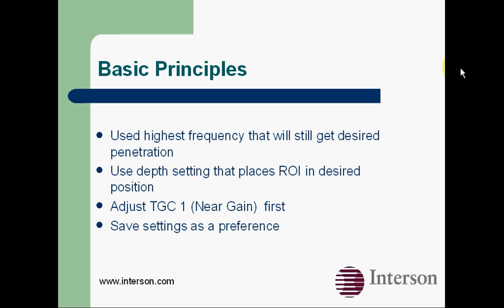You want to use a depth setting that places the region of interest in the desired position. The important thing to remember is to adjust the near gain, which is the TGC1, first, before you adjust the mid and far gains. You can then save these as preferences if you wish.